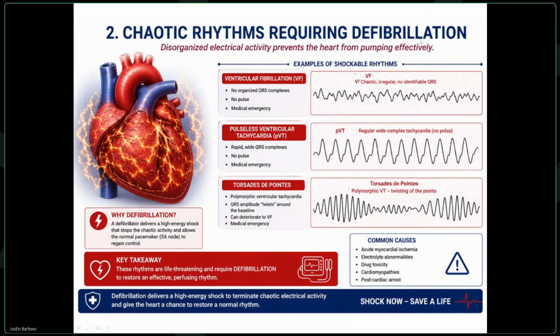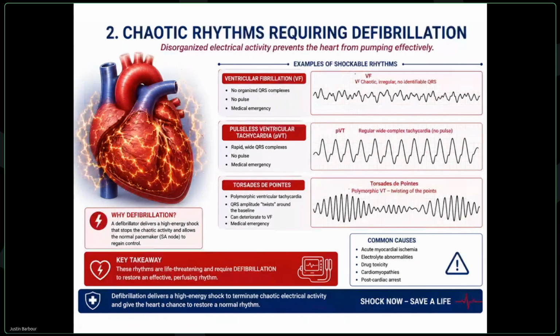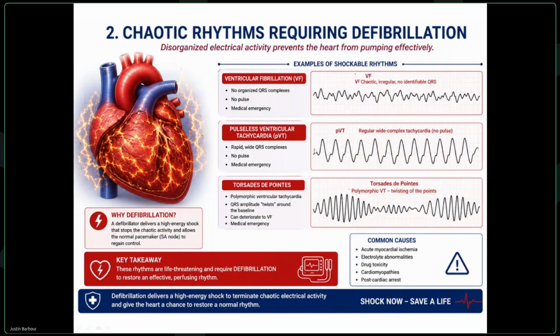Ventricular fibrillation needs to be defibrillated, which is why we have defibrillators. The defibrillator will send a shock of energy into the heart, and it basically is like hitting the reset button, hopefully. And you can see down here, I also have pulseless ventricular tachycardia. Tachycardia and bradycardia are also a kind of symptom that can be paced through regular pacing.